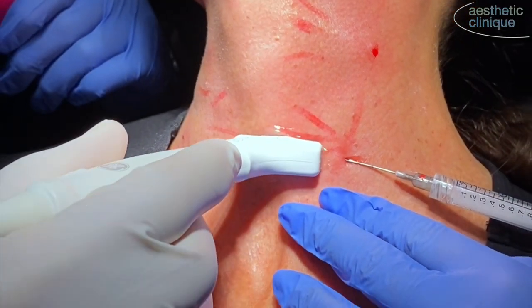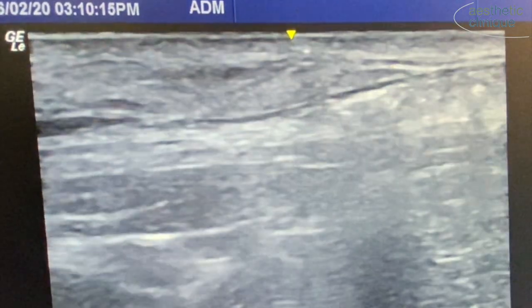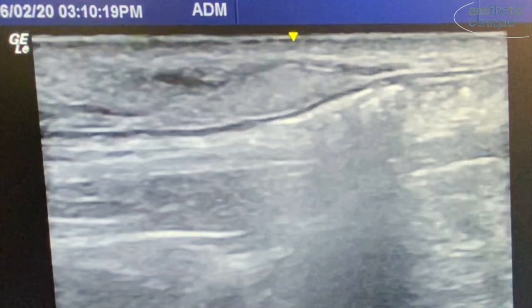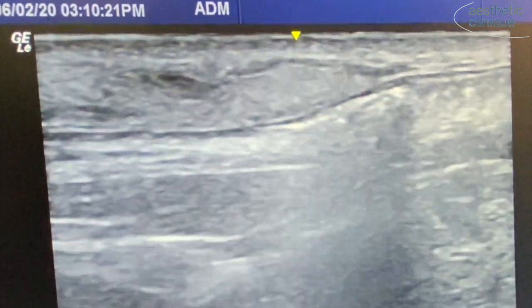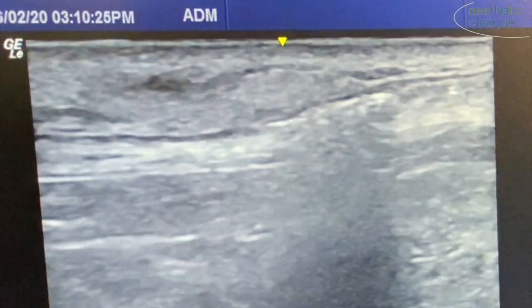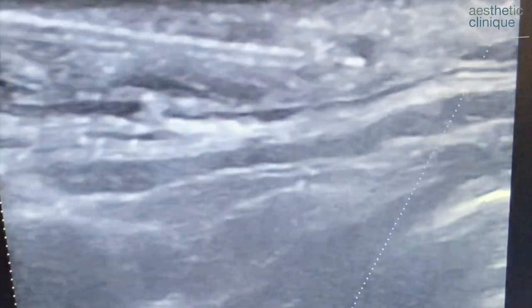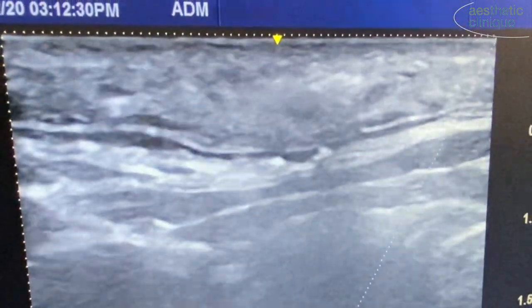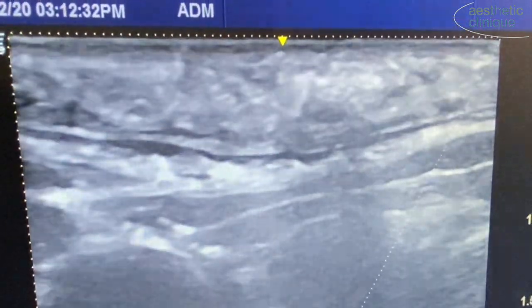I will now show, using high-frequency duplex ultrasound, the injection of the Radiesse with an in-plane hockey stick probe. You can see that the Radiesse is being placed in the immediate sub-q tissue, and beneath that you see the platysma.